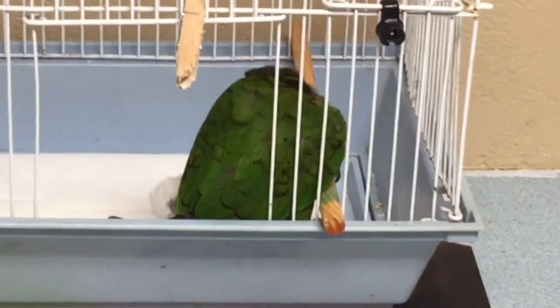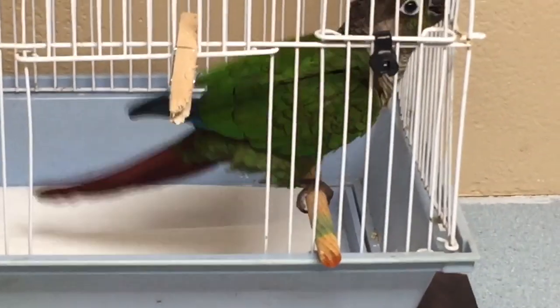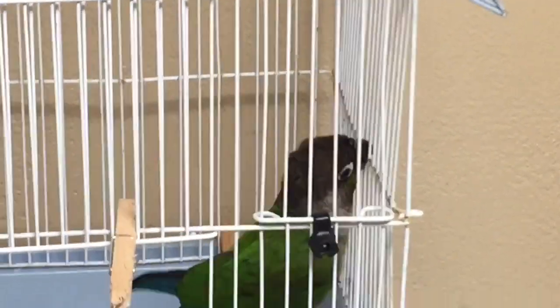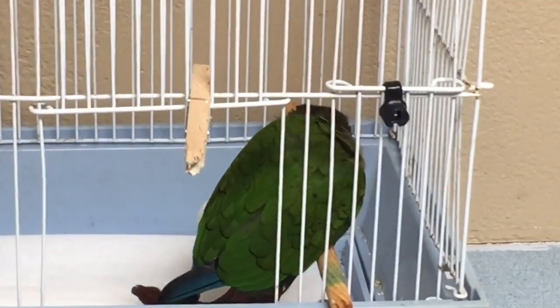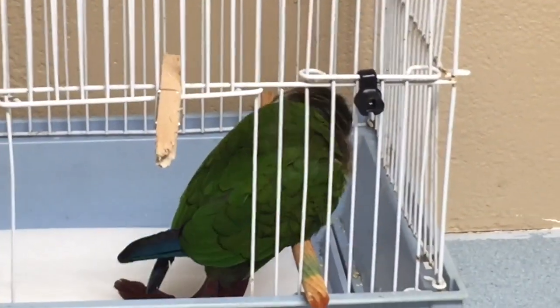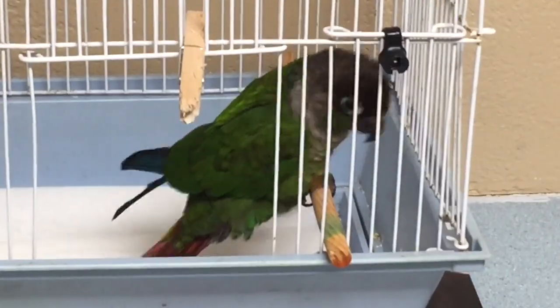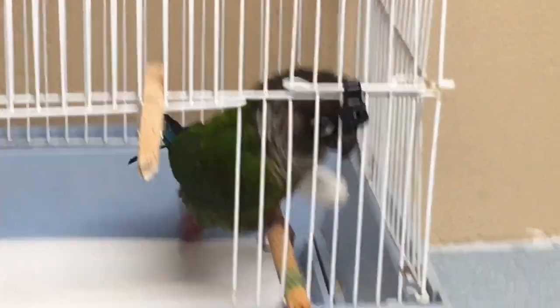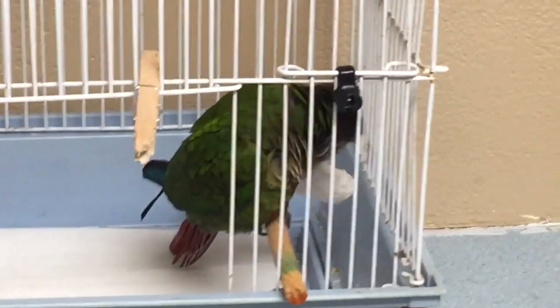I can remember two offhand, but we had to modify it again and even shorten it for this guy. This is not a new technique — it's just something that you don't see very often in birds. I want to get an x-ray next week and we'll see how it's healing. There is even a good possibility, if this is not the fracture that she described and it's not the dangling that we were talking about, that this can come off next week permanently.